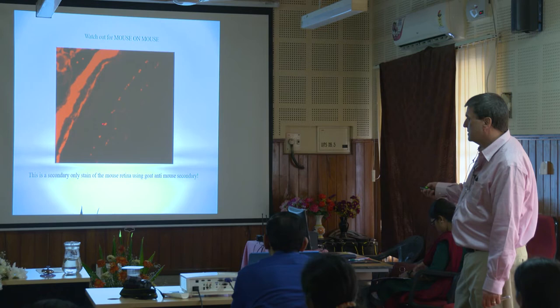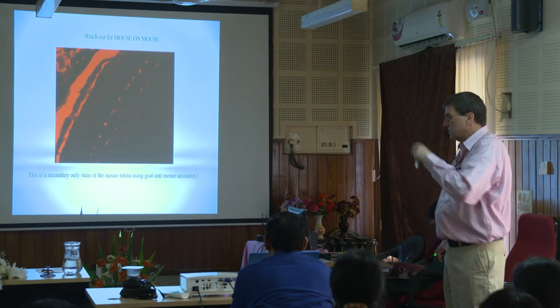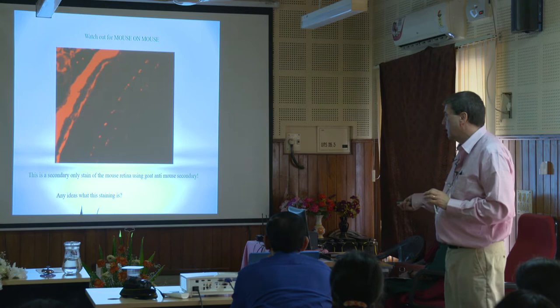So a lot of people run into this with mouse on mouse, because the antibody you've made and what you're targeting are the same species. So you get this cross-reaction like this. So be aware of that. Okay, any questions on what I just told you?